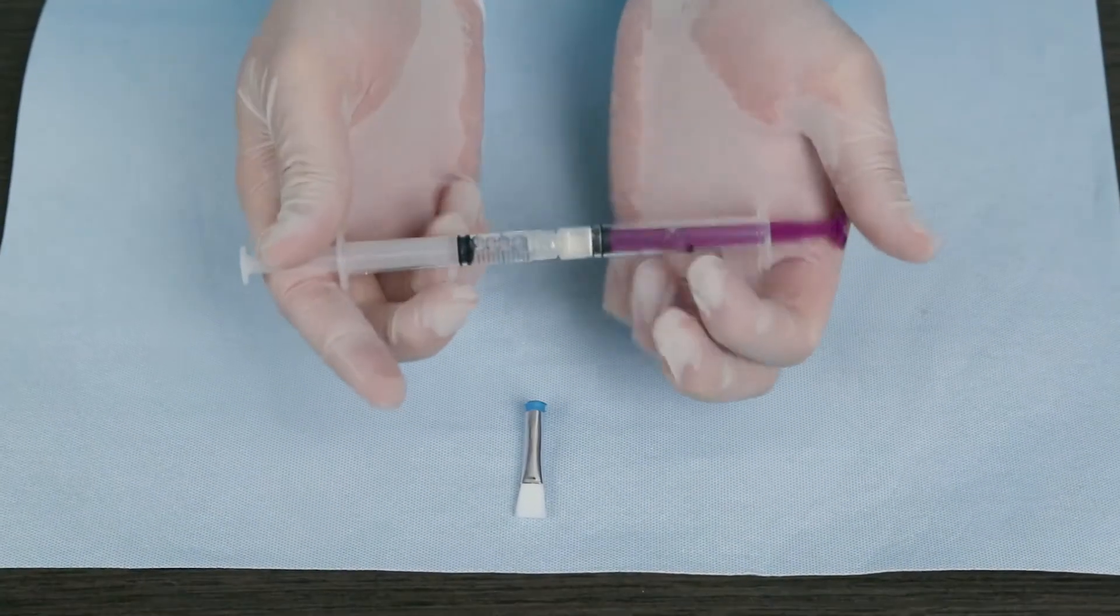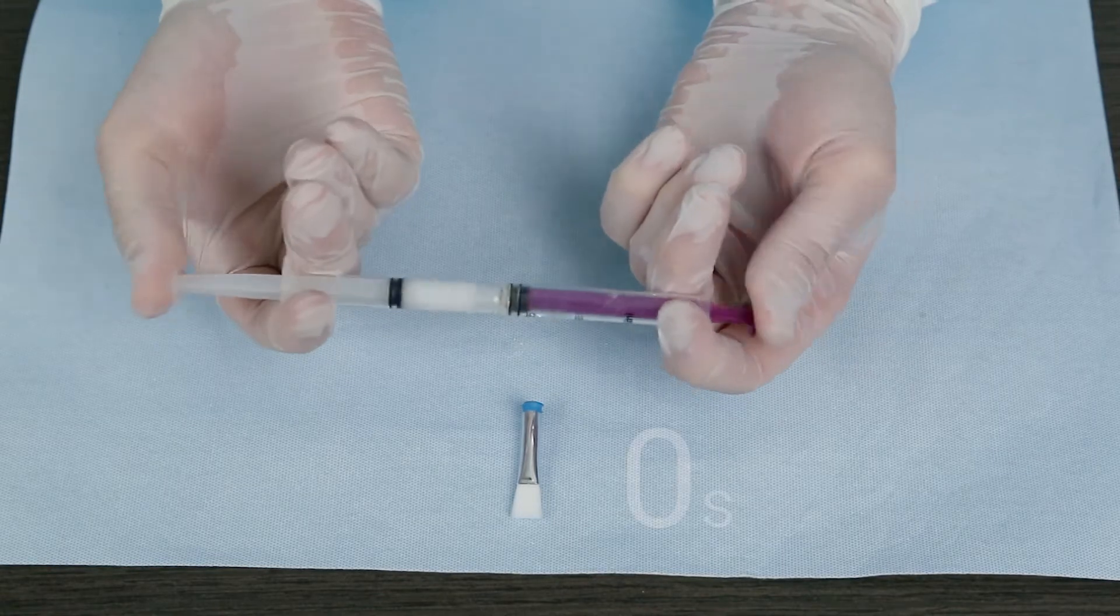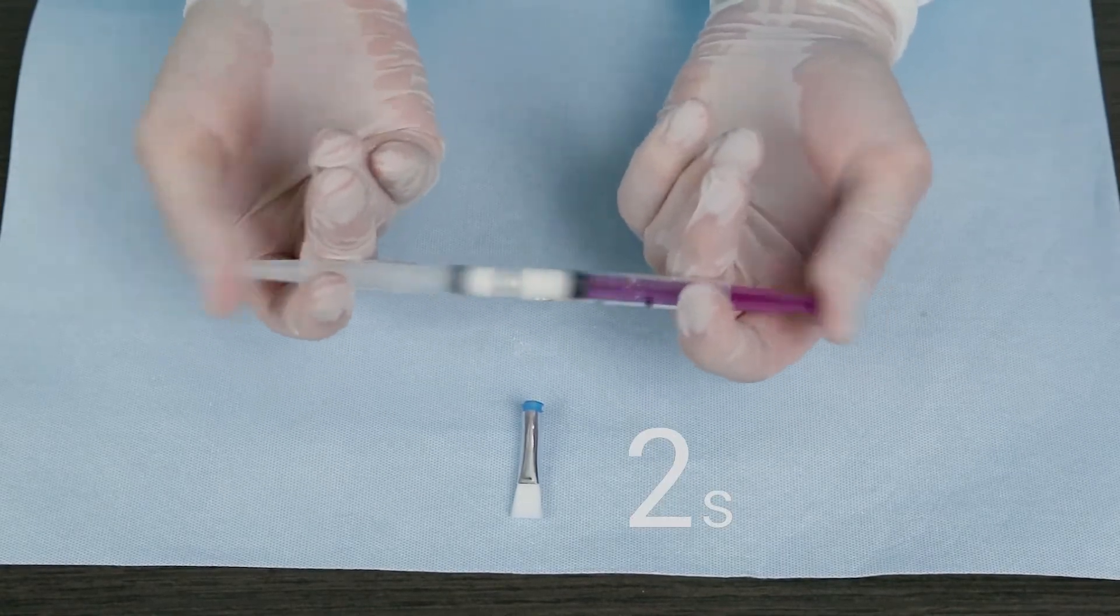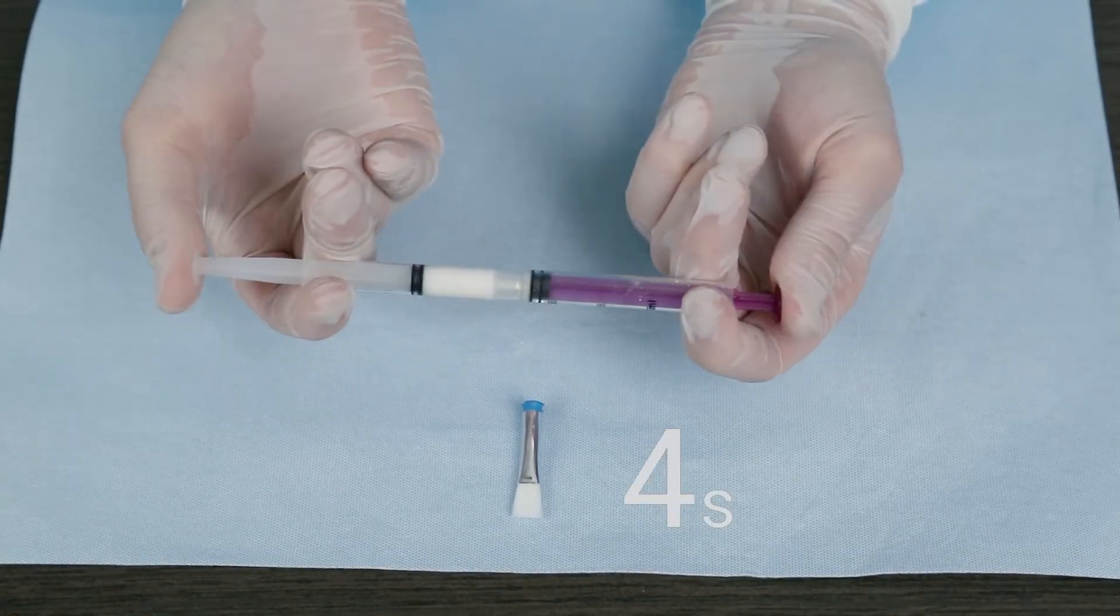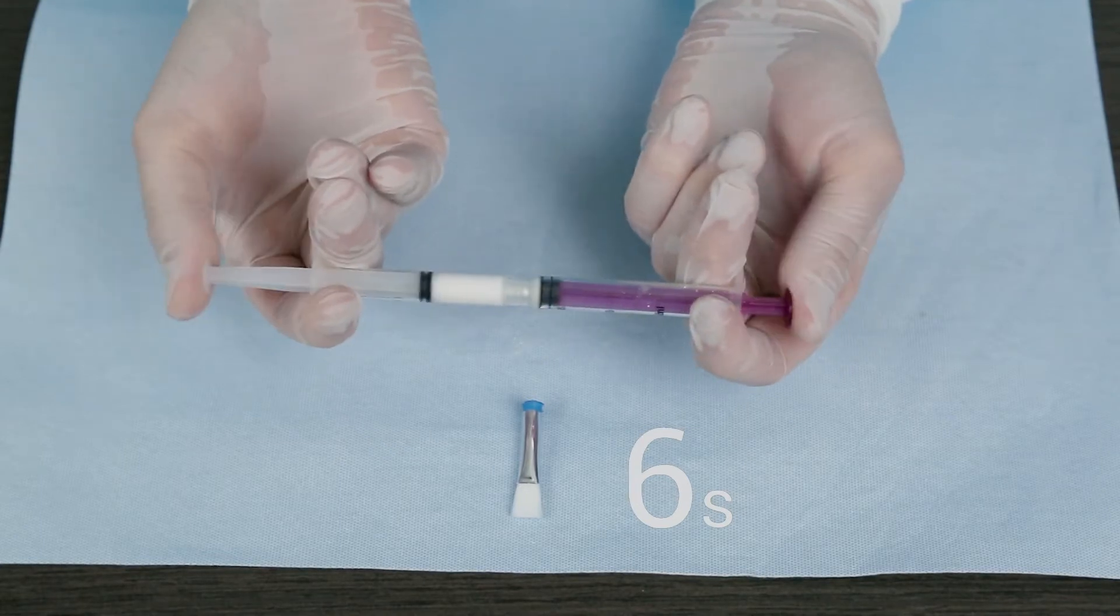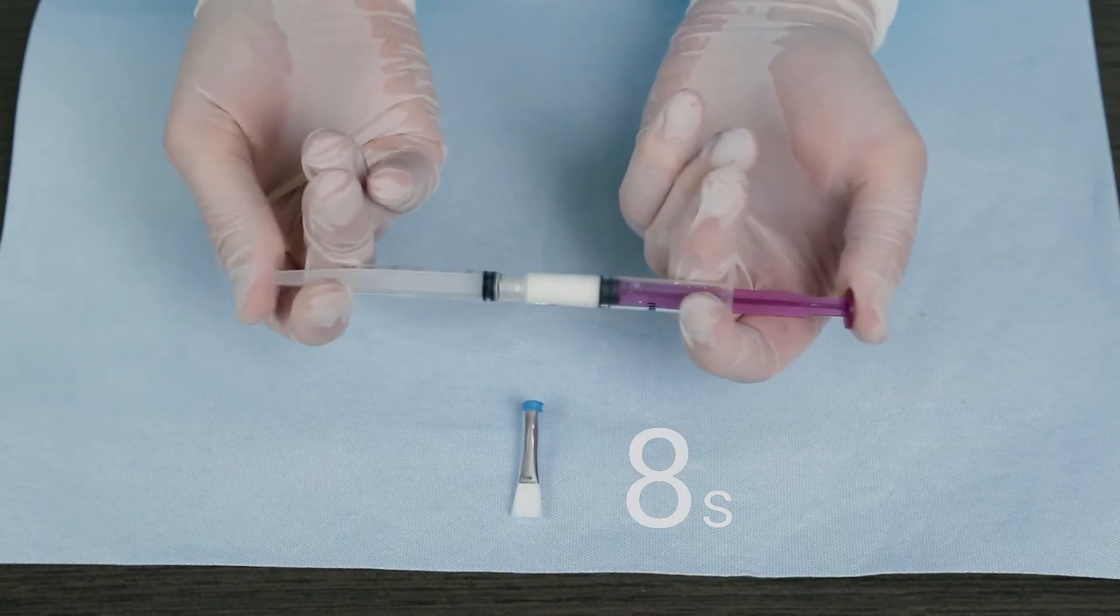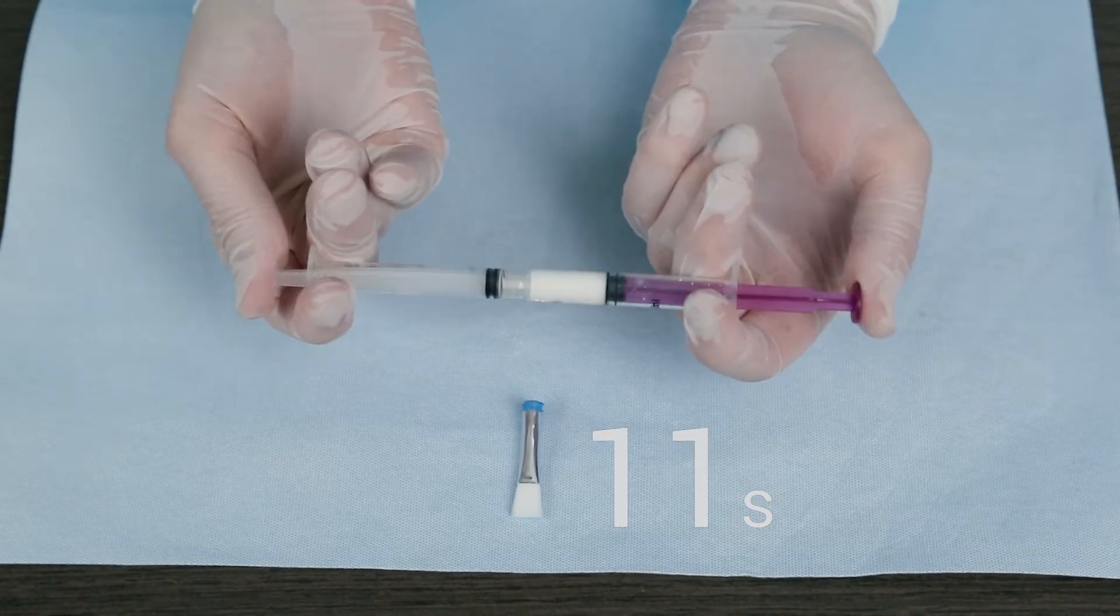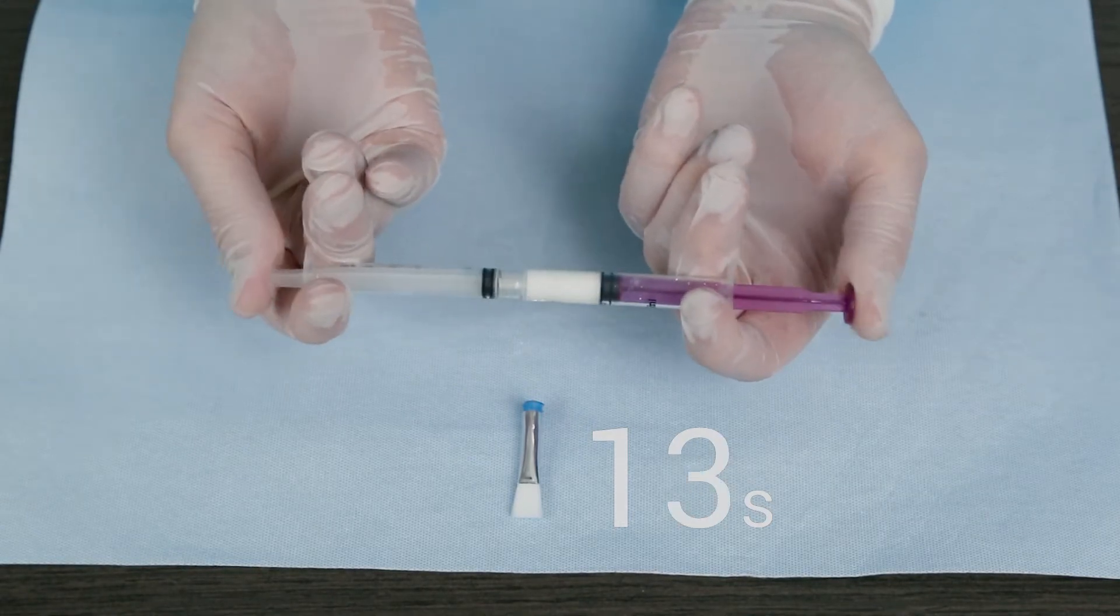You will mix the contents of the two syringes by vigorously pushing the plungers back and forth for 30 strokes, which is approximately 10 to 15 seconds. Consider using a timer as it is easy to lose track of time, which will cause the product to become too viscous to apply. The formation of tiny bubbles in the mixture is normal.